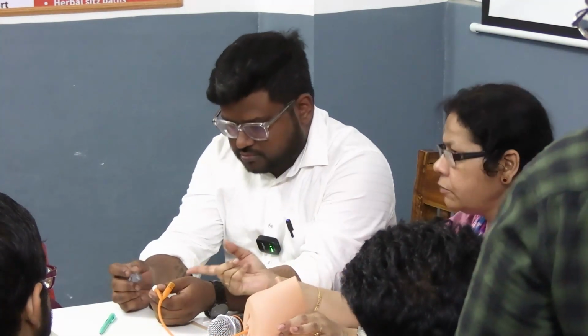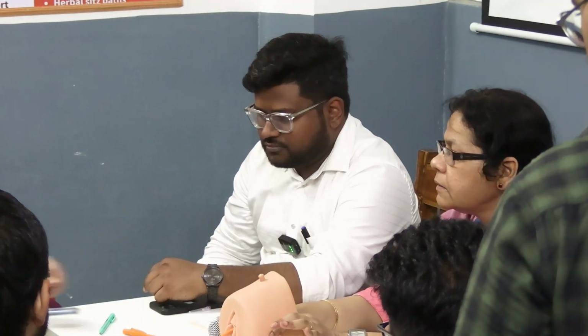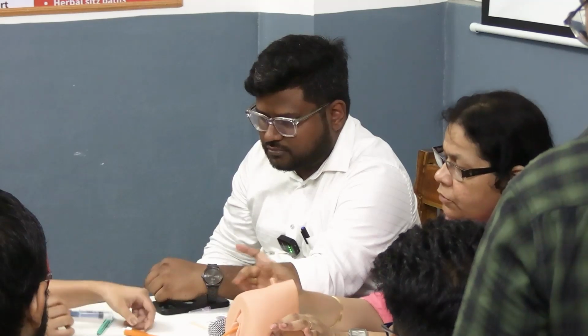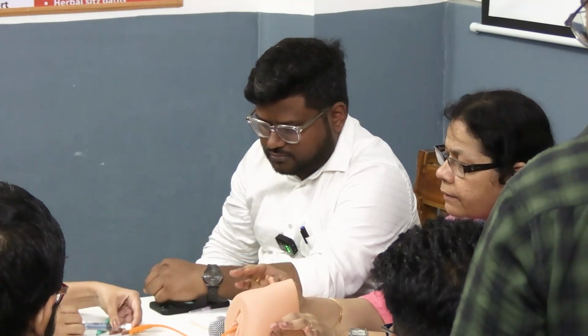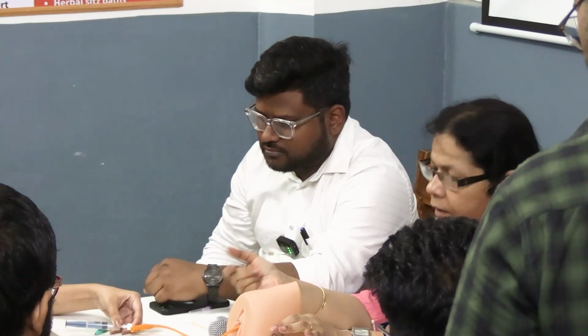Clear? How do you remove the Foley's catheter? Ask them. How will you remove? Deflate the balloon. How? Do it. Deflate the balloon first, then take out the catheter. What will you do? What will be your movement of the piston? Down and outwards.